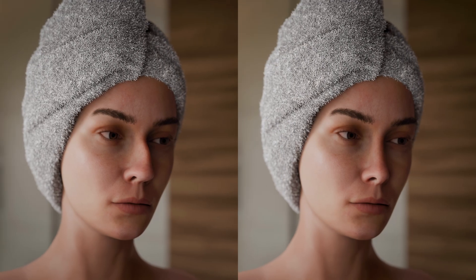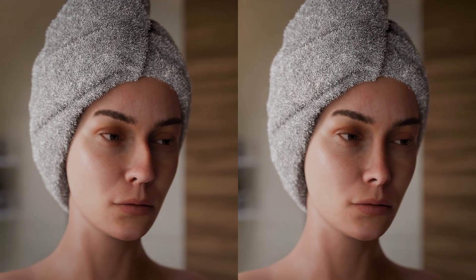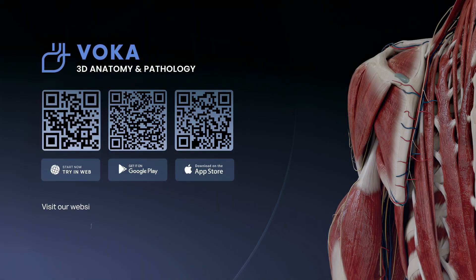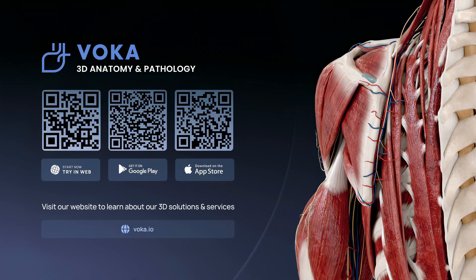Open rhinoplasty enables simultaneous correction of structural deformities and restoration of functional nasal breathing, offering both aesthetic and medical benefits.